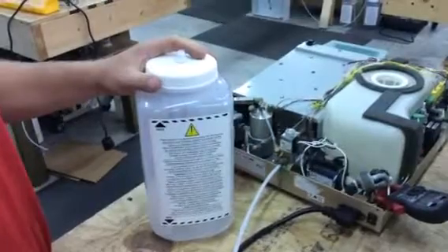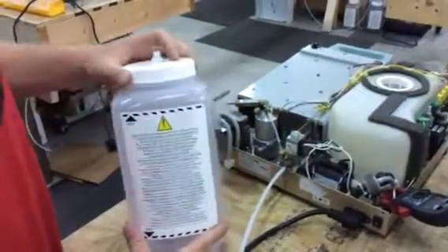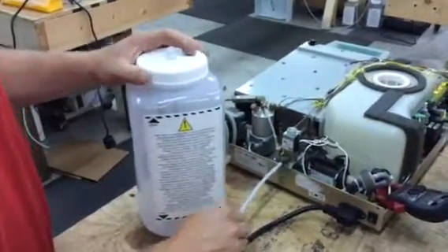Real quick, I'm going to show you how to install a waste bottle fitting on a STATUM 2000. Real easy.